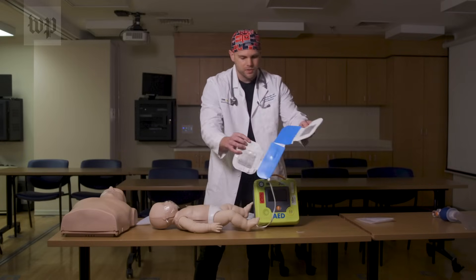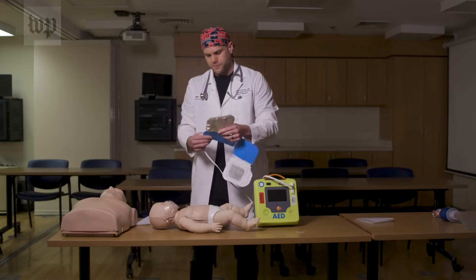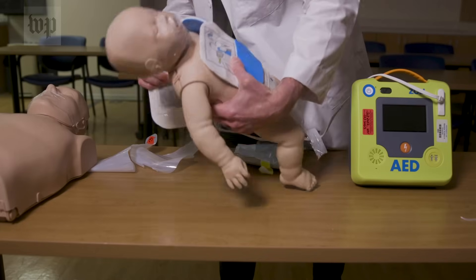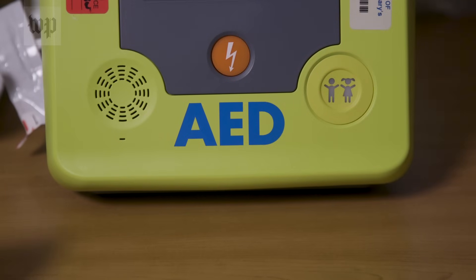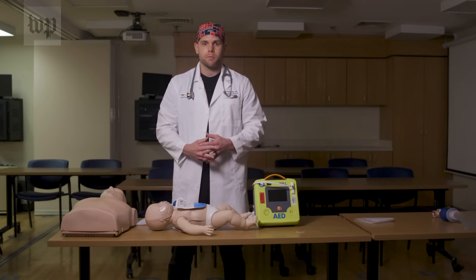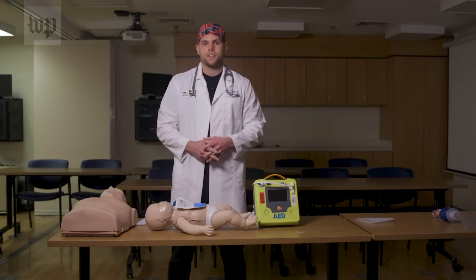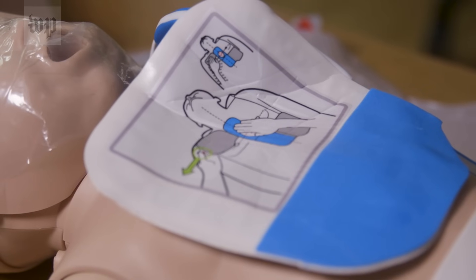For a pediatric patient, you would essentially follow the same steps as for an adult. You can use adult pads in a pinch if needed, by placing one pad on the front of the chest and the second pad on the rear of the chest. However, if you have access to pediatric pads and it's a pediatric patient, try to use those pads, because when you plug them into the device, it tells the device this is a child and changes the amount of electrical shock delivered. Just use adult pads if that's all you have access to.